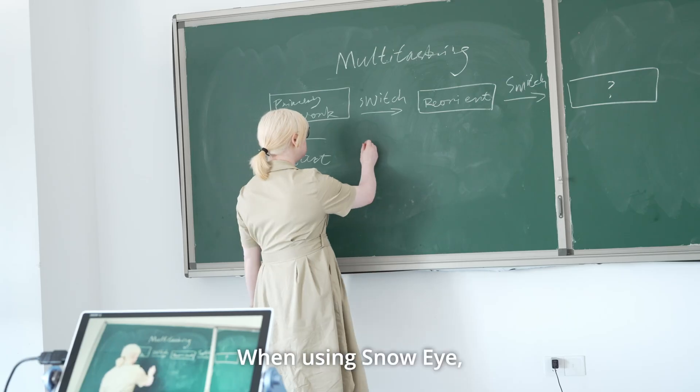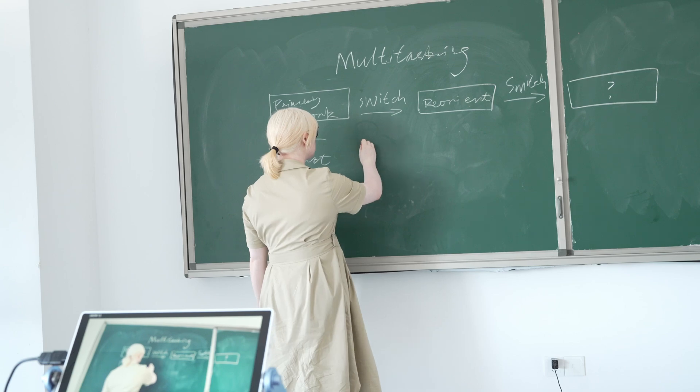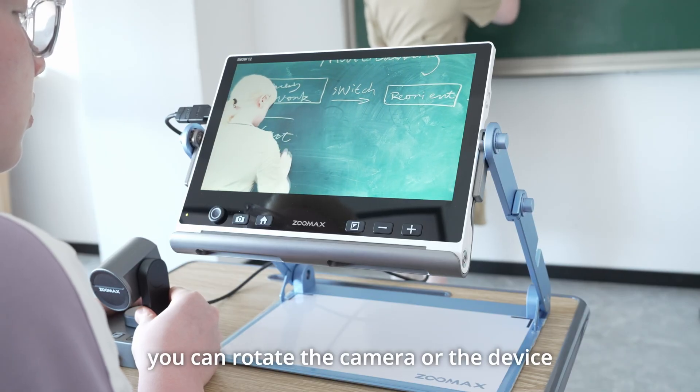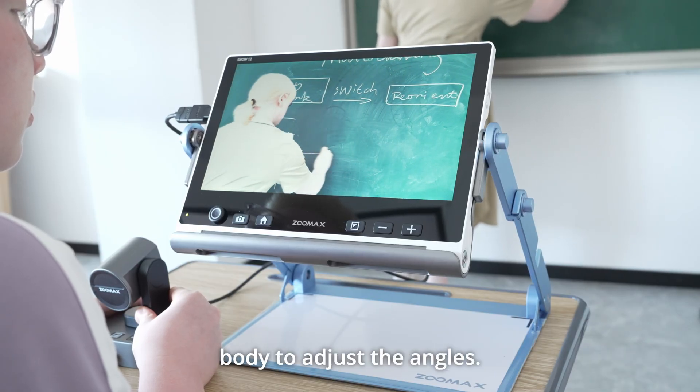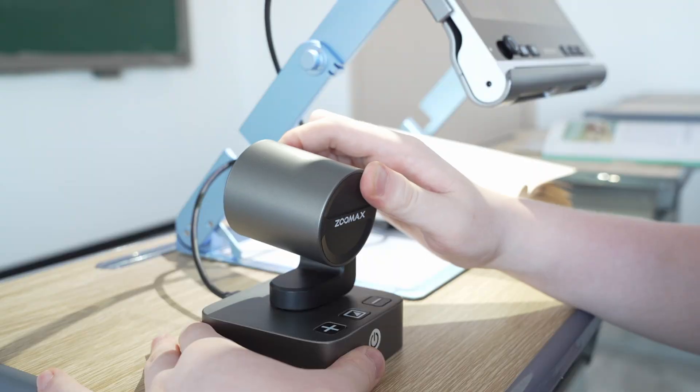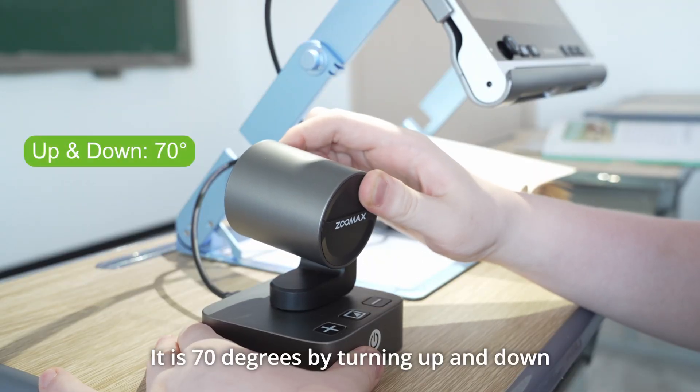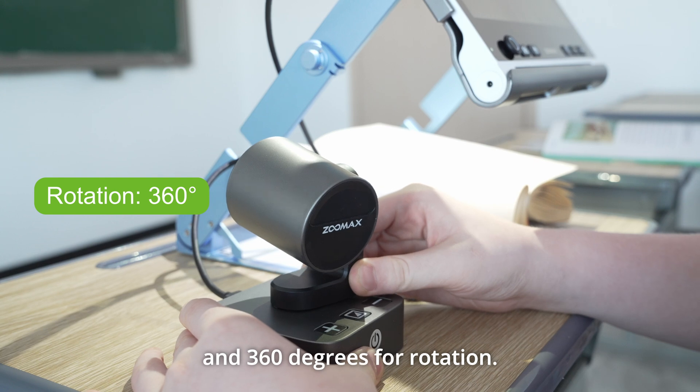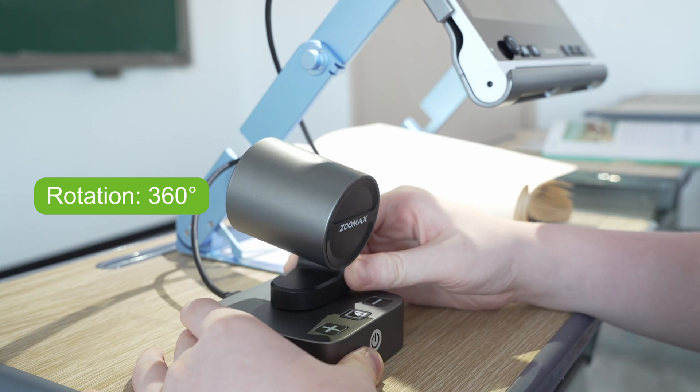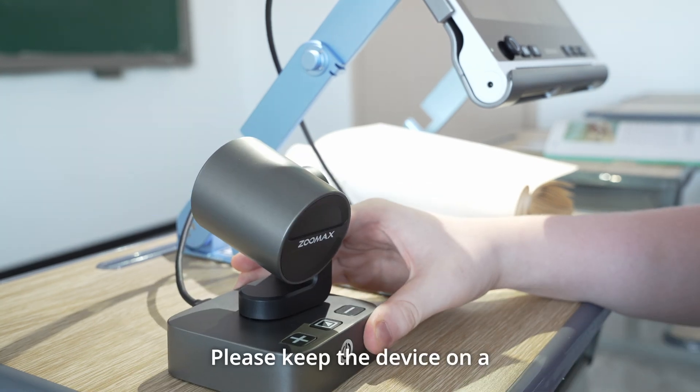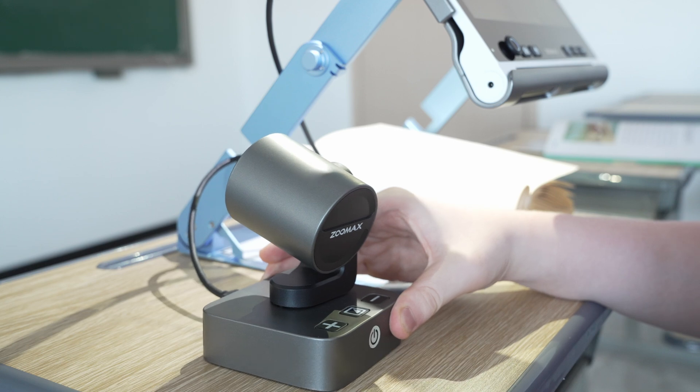When using Snow Eye, you can rotate the camera or the device body to adjust the angles. It is 70 degrees by turning up and down and 360 degrees for rotation. Please keep the device on a flat surface all the time.